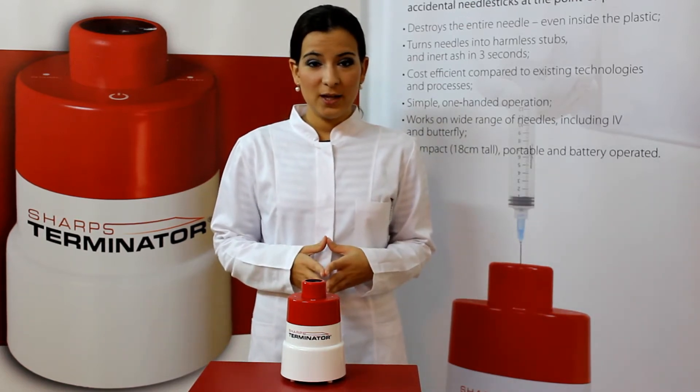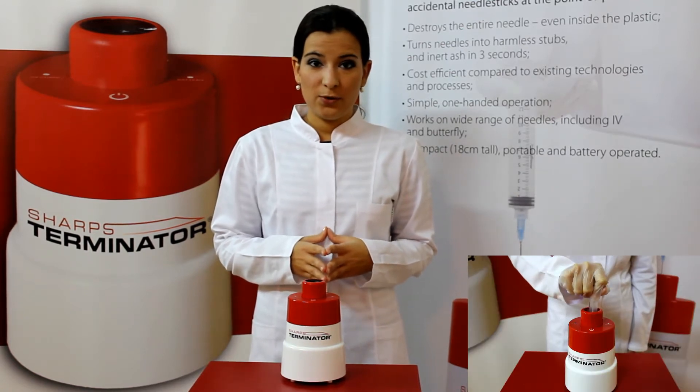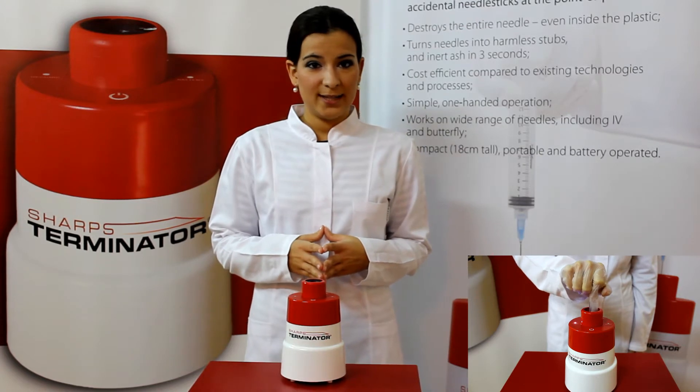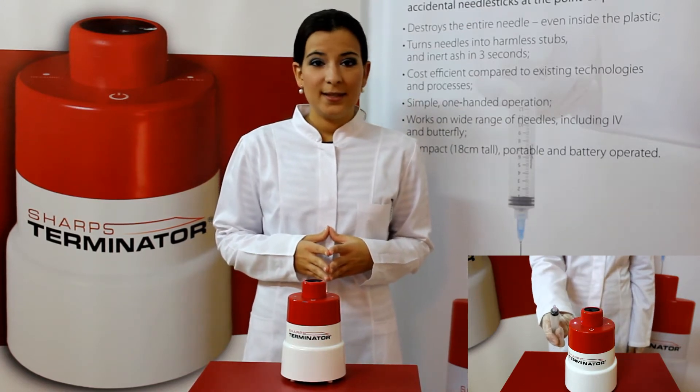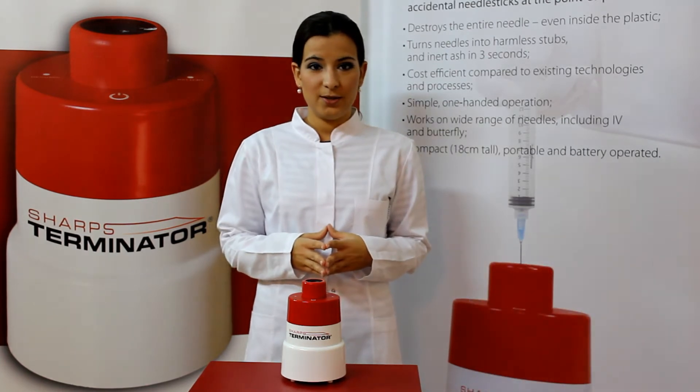The simple, one-handed technique of the Sharps Terminator destroys the entire needle at the point of procedure and reduces the chance for an accidental needle stick. This is done in such a way that the processed syringe is no longer considered sharp waste.